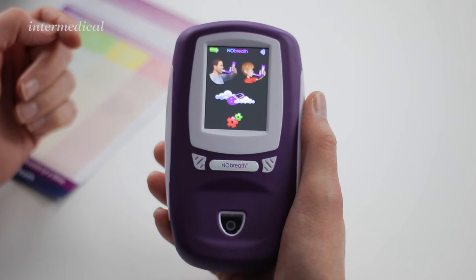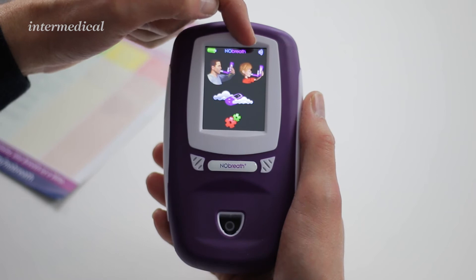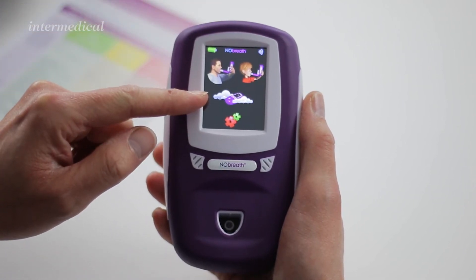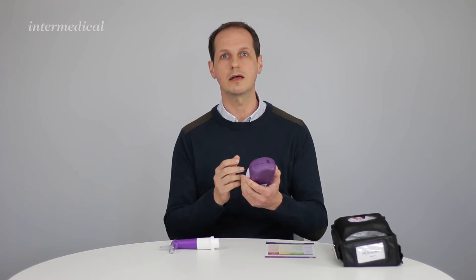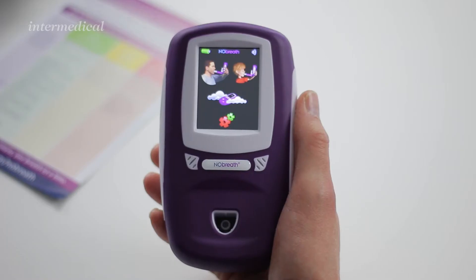Once the monitor has warmed up, on the screen at the top you have an adult setting and a child setting. In the middle you've got an ambient NO which measures the level of NO in the room, and at the bottom you've got a settings icon. This will allow you to set the date and time, switch the beep off on the monitor, and look at the last result recorded on the device.